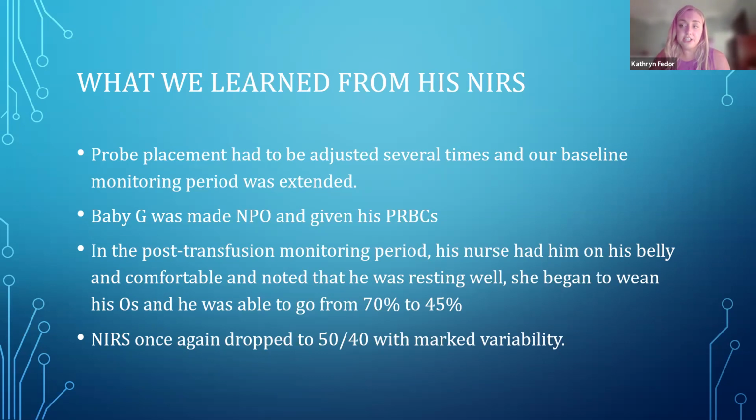So those were all conversations we had, but the baby did eventually, throughout his transfusion, come to what we would expect more of his readings to be. We didn't see that 15 anymore. It was sort of a more normalized reading. Baby was made NPO and given his PRBCs.